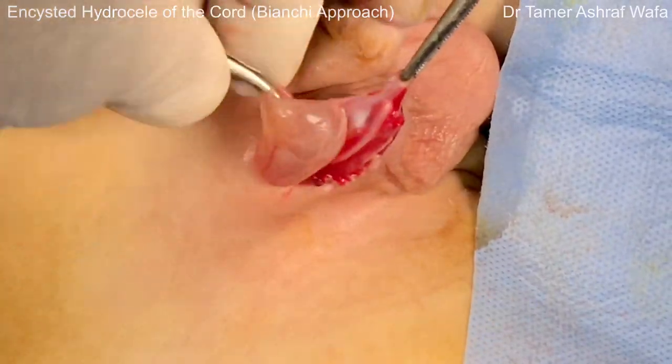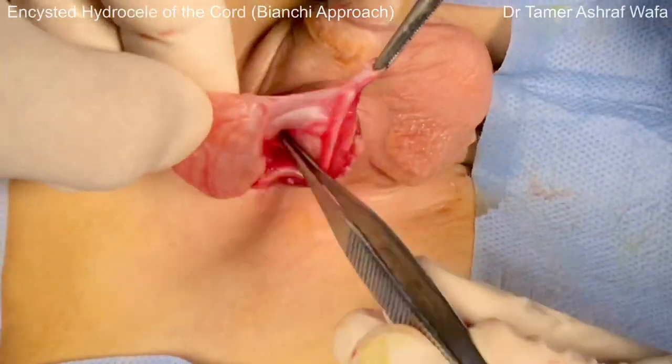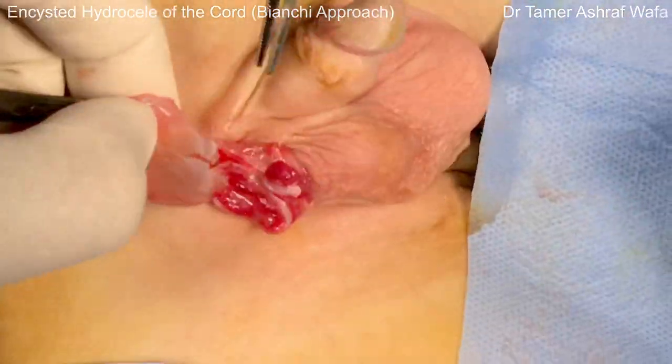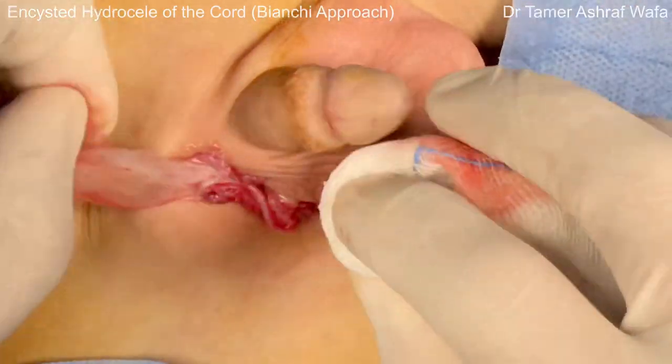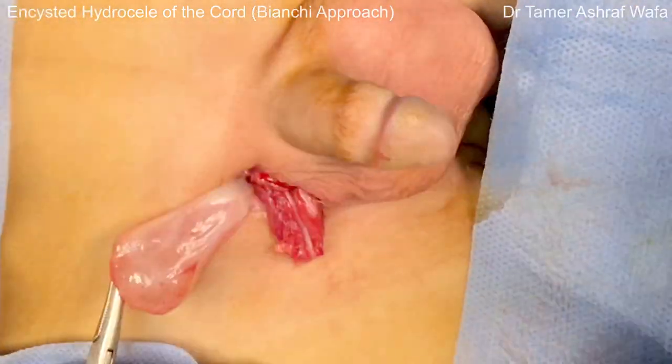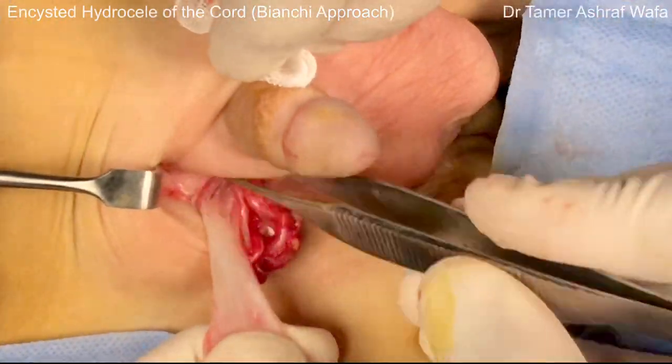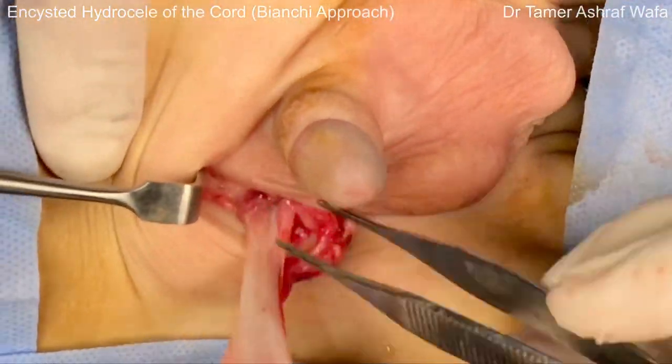The sac is dissected distally from the rest of the coverings. The dissection is continued proximally, facilitated by upward retraction until the proper neck is reached.